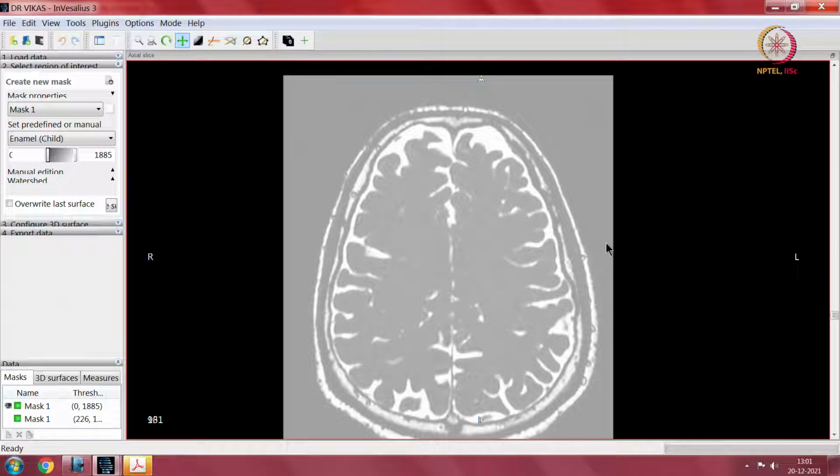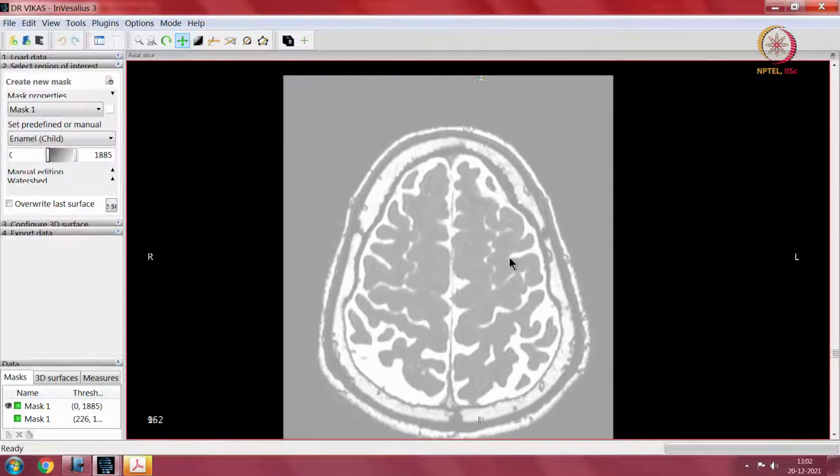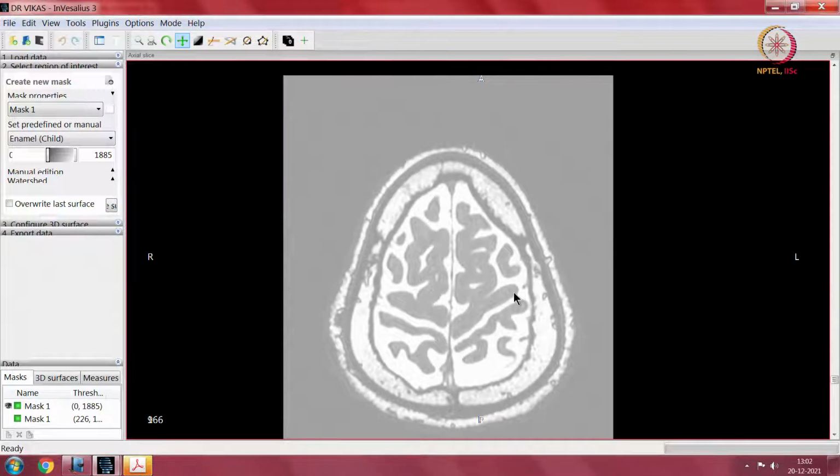comprehending brain anatomy, and especially intraoperative brain anatomy, when you do not have the skull and you have to interpret stuff which you are seeing on table from these kind of images which are axial images, sectional images. So, there is a lot of scorn dripping from my mouth when I speak about this.